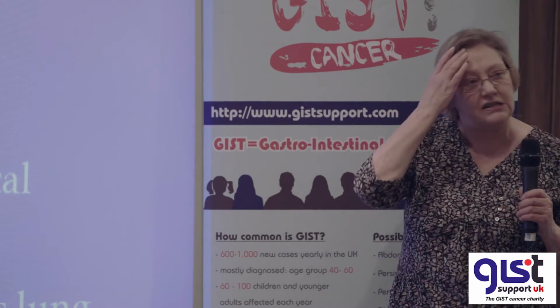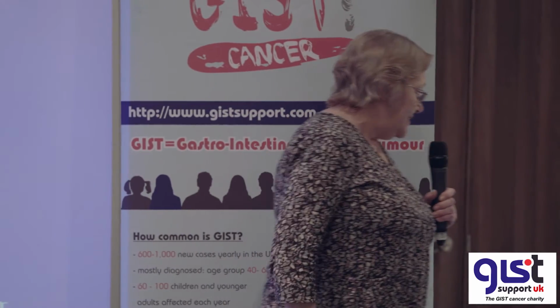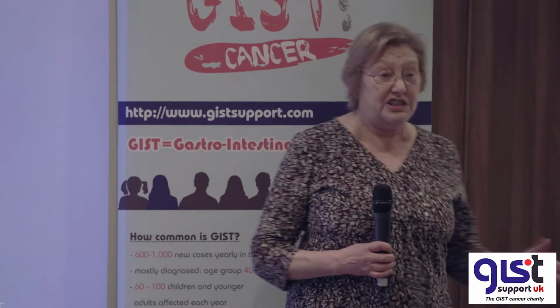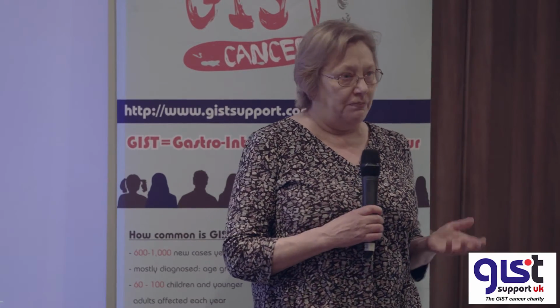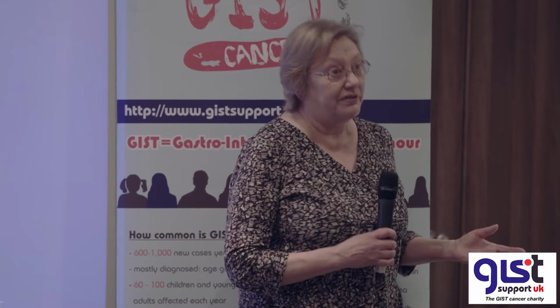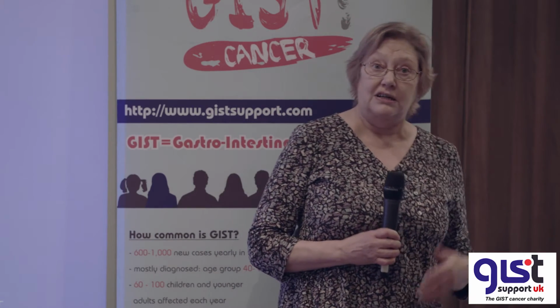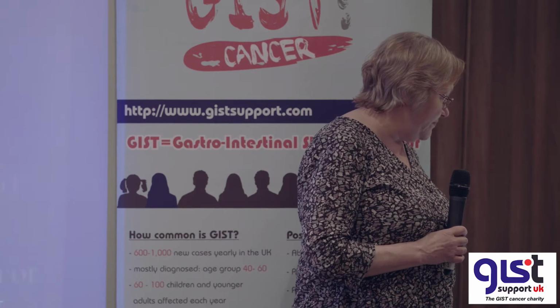What about other techniques? Some of you might have heard of PET-CT. Anybody heard of PET-CT? 21% of GIST don't show any PET uptake. These really low-grade ones, like the ones you see in the stomach, are not busy enough, not reproducing fast enough to show up on PET, so it's not helpful. It's most useful where the CT scan is equivocal, so we're not sure whether it's disease or not, but obviously only if it takes it up. It's routinely used in certain cancers, such as lung cancer, to stage it, and in lymphomas to see what the residual disease is doing, but we don't use it very much in GIST.